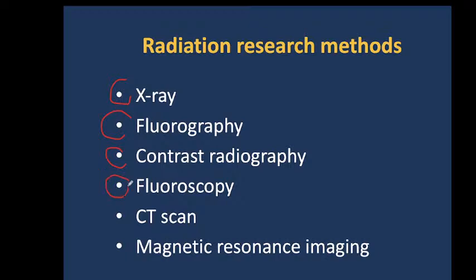Fluoroscopy is movie diagnostics, dynamic diagnostics with X-ray. CT scan and magnetic resonance imaging are modern methods, and they are more and more used in clinics now.